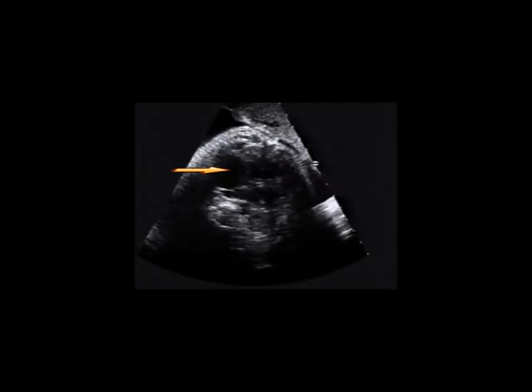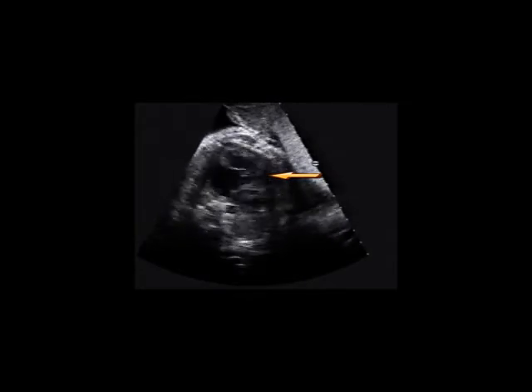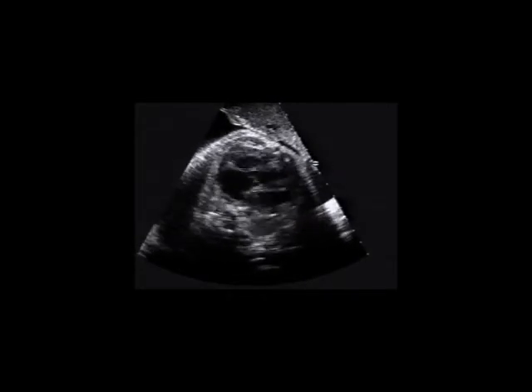В данном видеоматериале стрелками обозначены значительно расширенная полость правого предсердия и расширенная полость правого желудочка. Каких-либо врождённых пороков сердца в данном наблюдении выявлено не было.